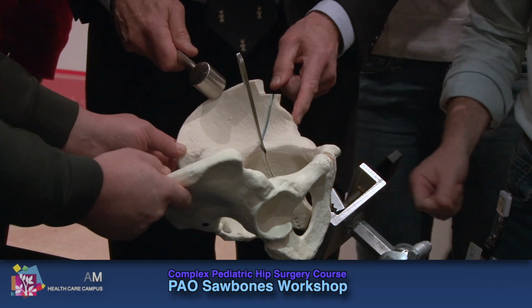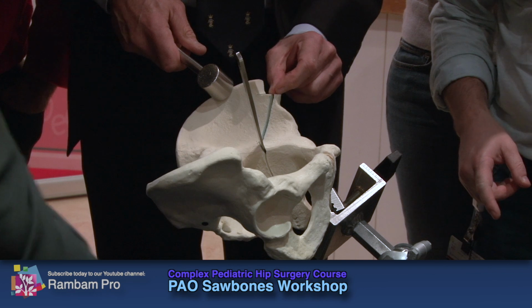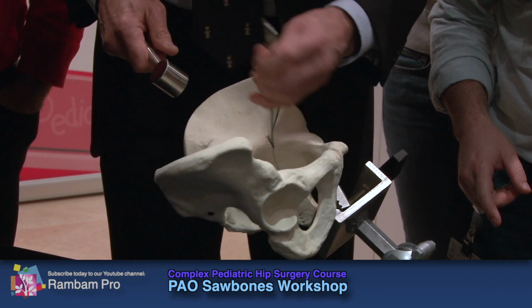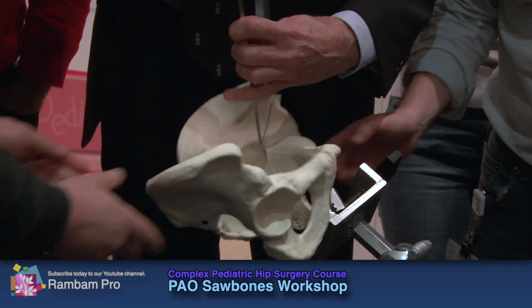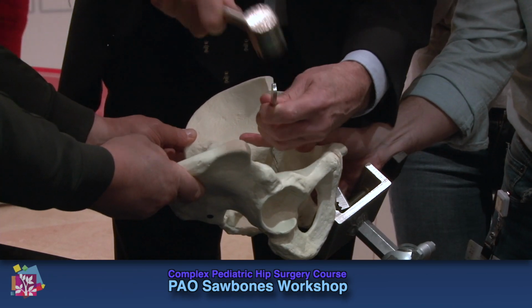You see it start to open up here? Then I can put my shank screw in here. Put a downward thread in there, put it under tension, continue to work this part. Extend down the back here.